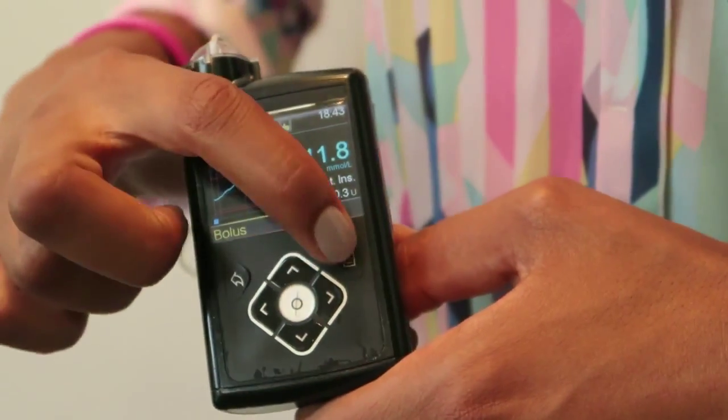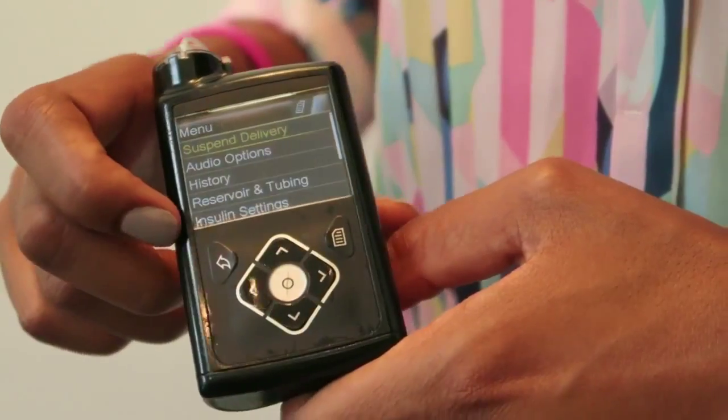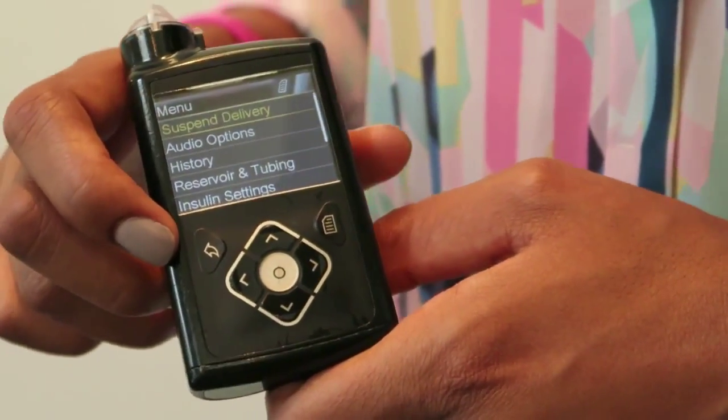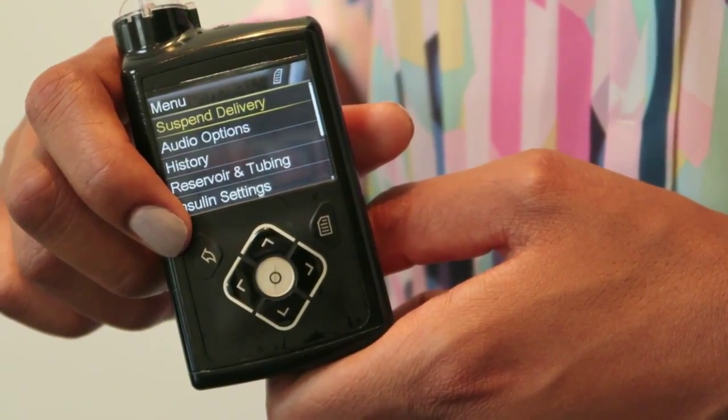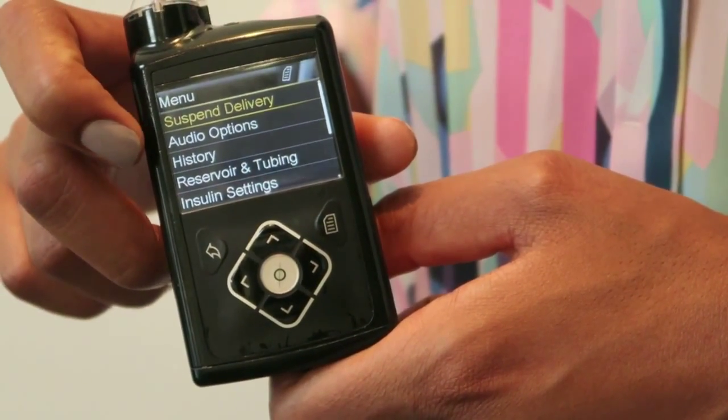To get to the main menu, you press this button here. Our first option here is suspend delivery. So if you needed to stop the insulin delivery for any reason, that's the option that you press.